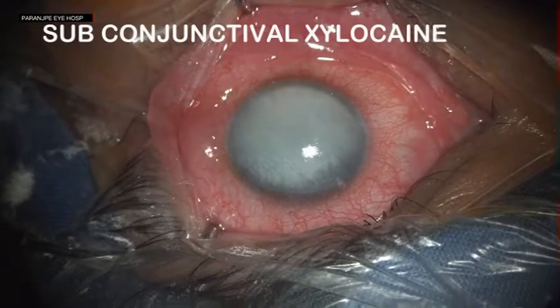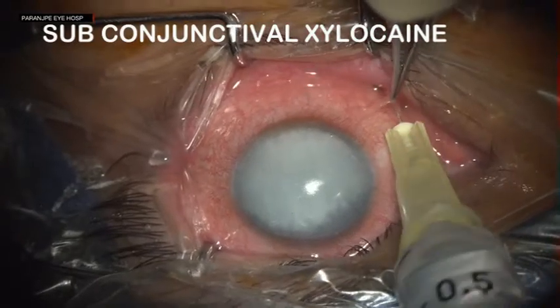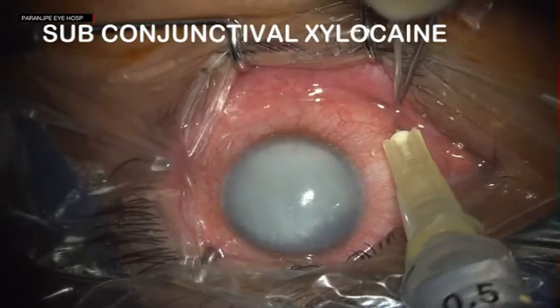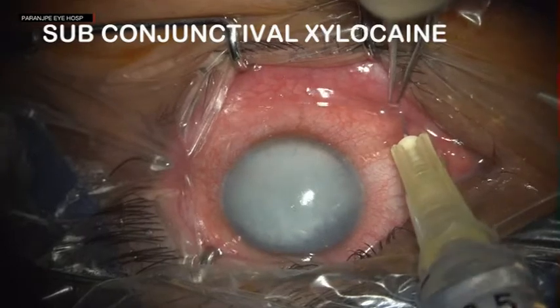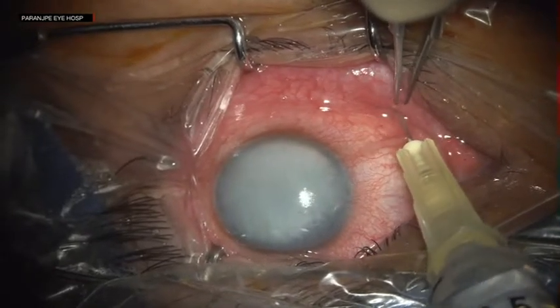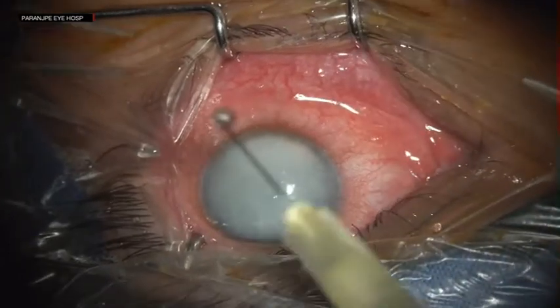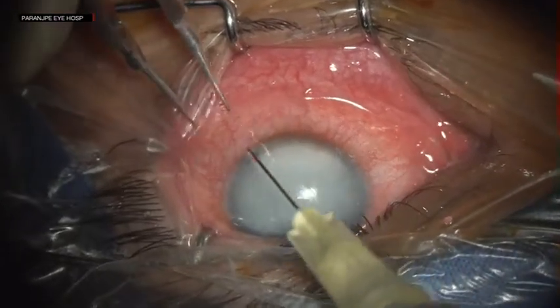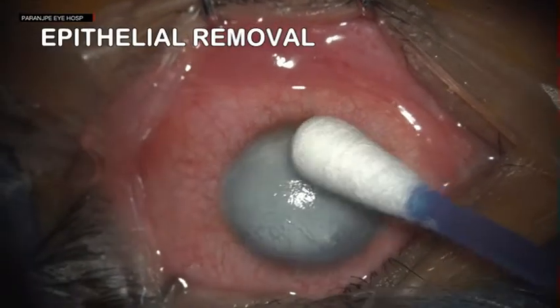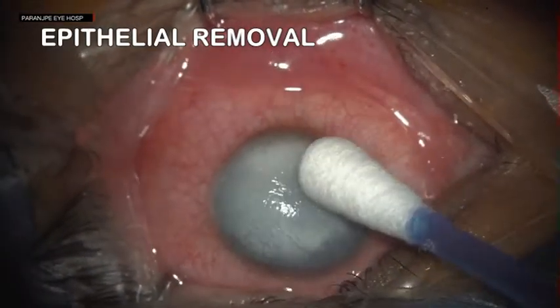The patient had no perception of light vision following trauma 15 years ago. The surgery was done under a sub-tenons injection. It can also be done under topical anesthesia if the patient is cooperative. After the sub-tenons injection, the epithelium is debrided so that we get a good penetration of the pigment.